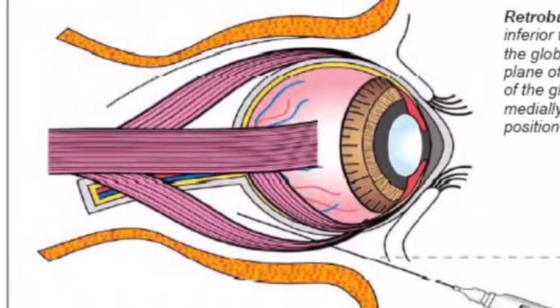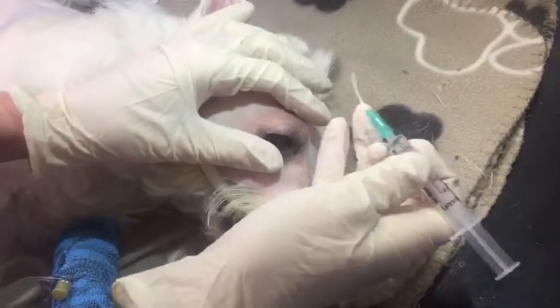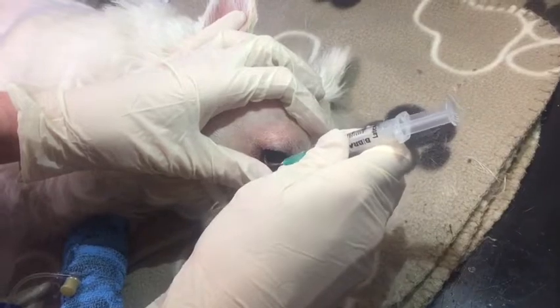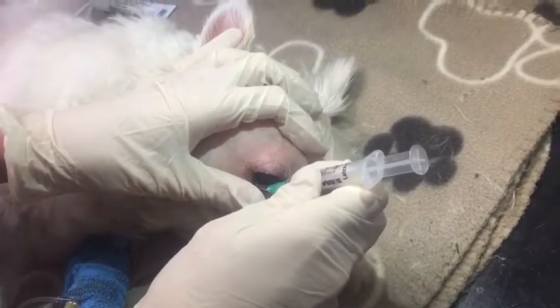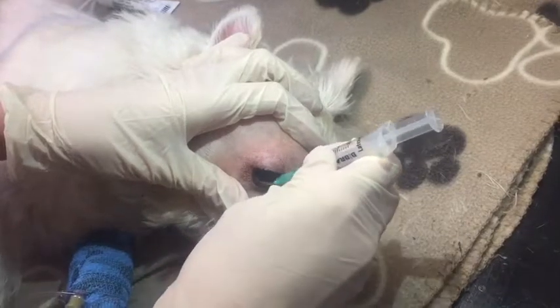In this procedure you need to pre-fill a syringe with a calculated amount of bupivacaine appropriate to the patient. Then place a 1 to 1.5 inch needle and gently bend that needle so it has the curve of the orbit.